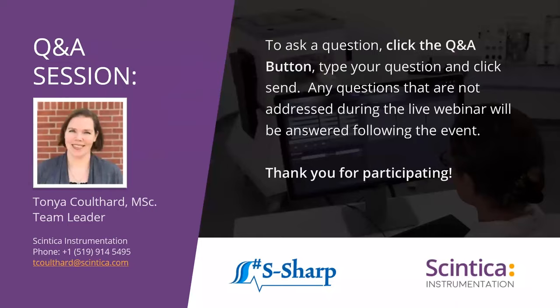And so right now, I'd like to bring Martin back on board, and we can start by answering some of the questions that came through before the webinar started today. We can address those, and like Martin mentioned, any of those which we're not able to address during the question and answer today simply because of time, we will prepare a transcript and send that out to everyone that should have all the answers that you're looking for. If you come up with other questions as you think about how you could use this in your lab, feel free, of course, to reach out to us, and I'd be happy to address any questions that you come up with.